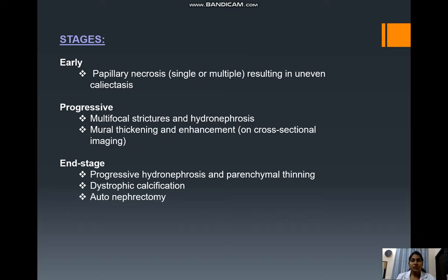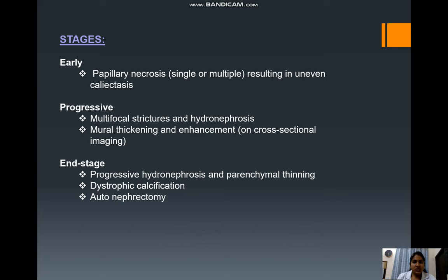The stages of disease are classified as early, progressive, and end-stage. In early disease, radiological features show papillary necrosis — single or multiple — resulting in uneven caliectasis. In the progressive stage, images reveal multifocal strictures and hydronephrosis associated with mural thickening and enhancement on cross-sectional imaging. End-stage disease shows progressive hydronephrosis and parenchymal thinning with dystrophic calcification, with or without autonephrectomy.